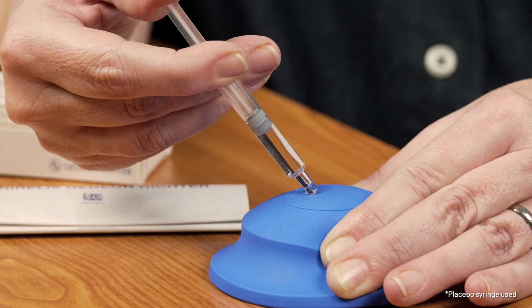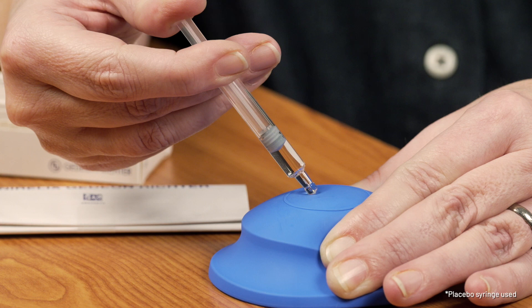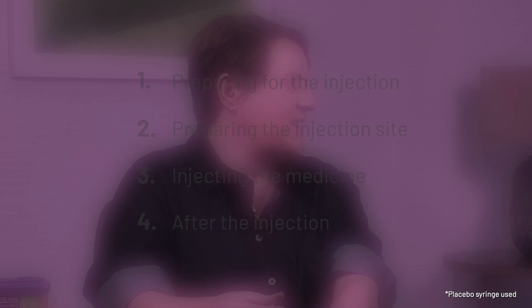If you're happy the needle has been placed correctly, push the plunger down with your thumb slowly and steadily until the syringe is empty. You're nearly there — there's just a couple of things to remember after you have injected.